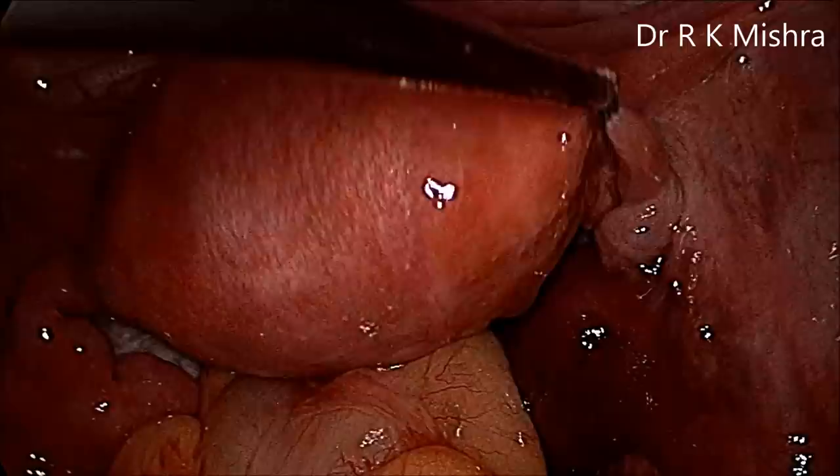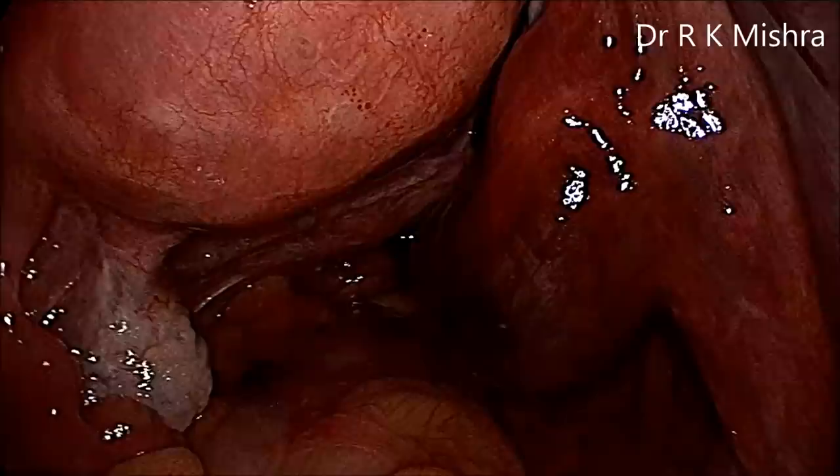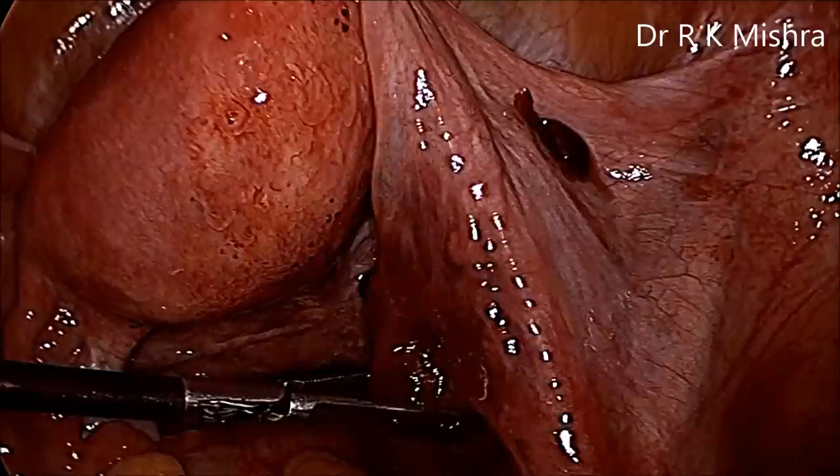Now this is the Stryker mini-laparoscope. We can see the left tube and right tube. With an atraumatic grasper, anteromedial traction is given over the ruptured part of the tube.